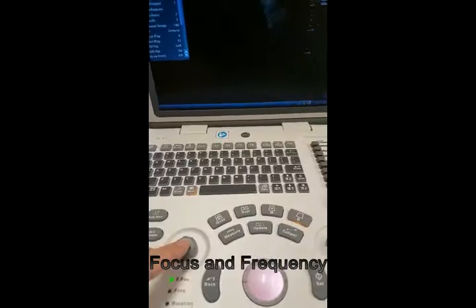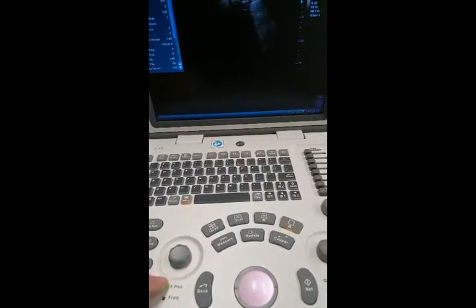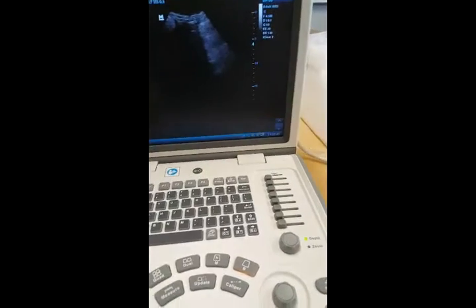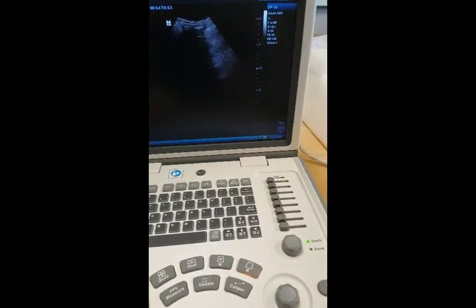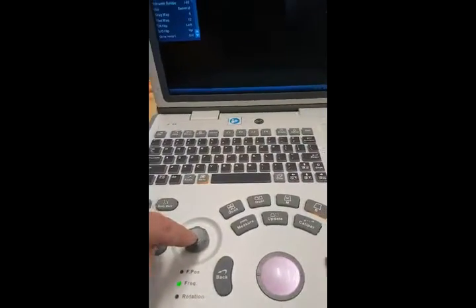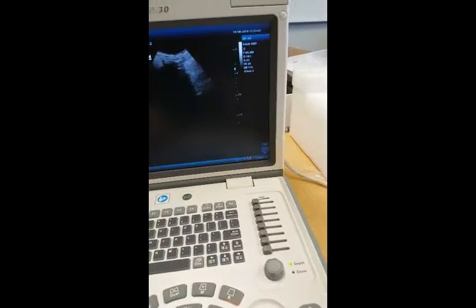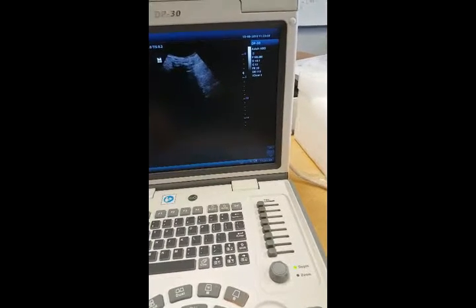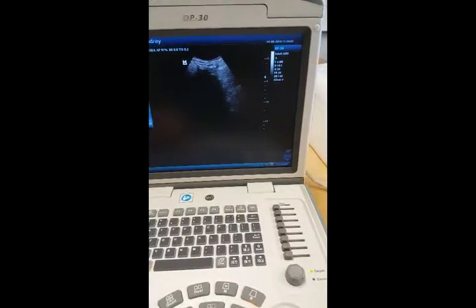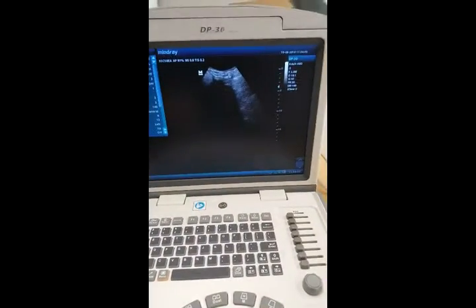This little knob here does the focus position and the frequency. You can just rotate the button to change the focus position once it's highlighted, and you'll see that happening here. Once clicking down on that button, it'll change the frequency, which changes the frequency here — you can see it going from 6 right down to 2 MHz. So that's that knob.